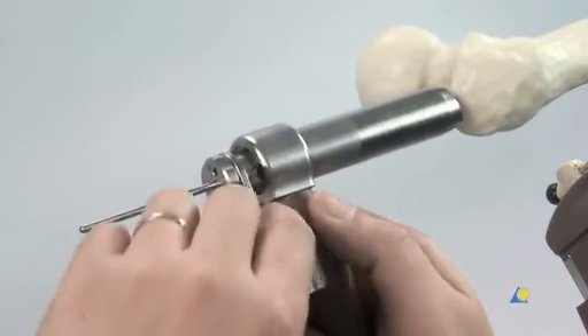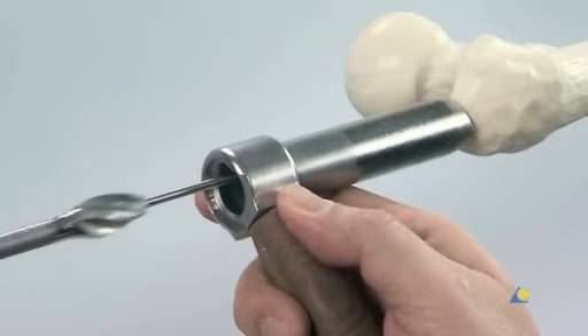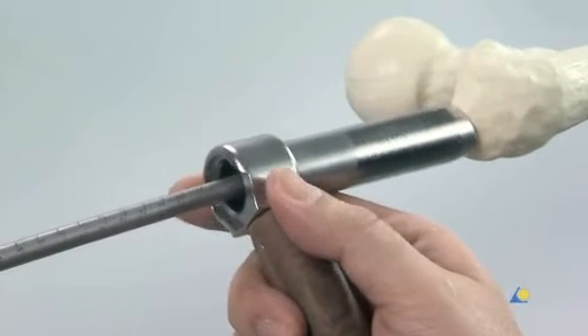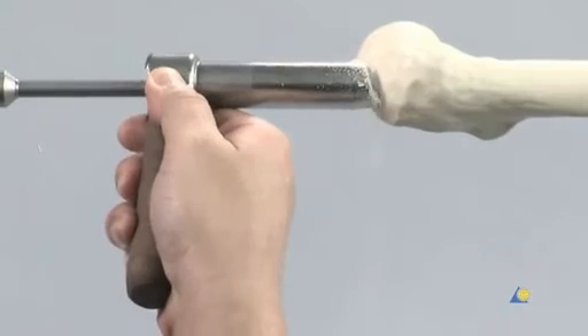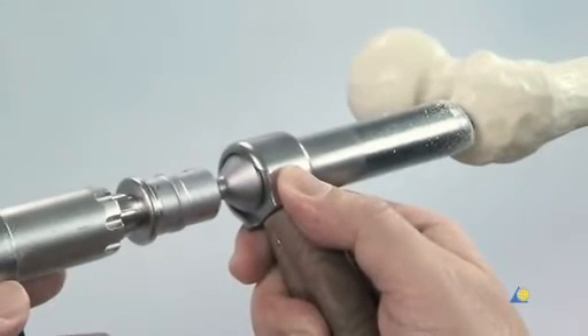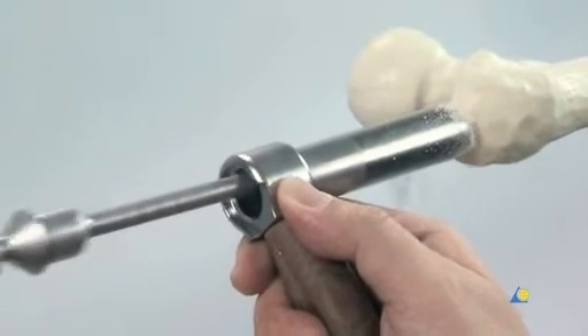The drill sleeve is removed. The cannulated flexible 14mm opening drill bit is slid over the guide wire and through the protection sleeve down to the bone. The bone is drilled as far as the stop on the drill bit using a power tool. The drill bit, the protection sleeve, and the guide wire are removed.